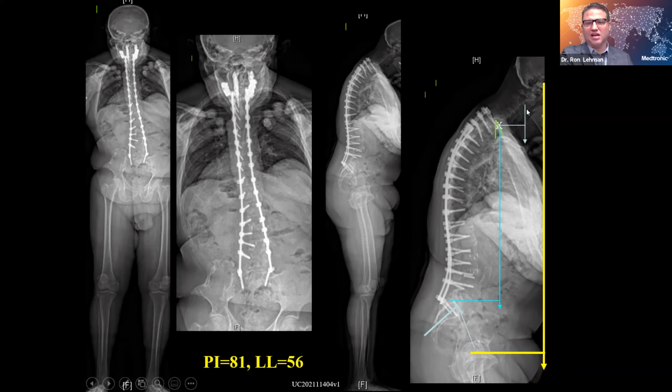So when we look at the rods, we often look at this and say, well, that doesn't look too bad. It's got to be a cervical problem because his head's hanging off. We look at the lumbar spine, we look at the rods, we're like, they have some lordosis there, so it's probably not that. But we really have to differentiate looking at things like TPA and the C2 or the CTPA as well to say, is this a cervical thoracic problem, or is it a lumbosacral problem, or really is it the rare hybrid where it's both? And so in this particular case, I thought it was both.